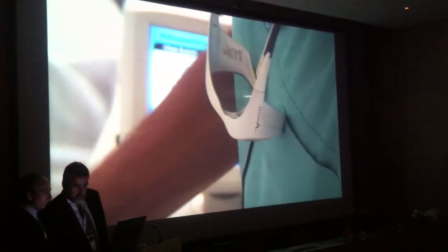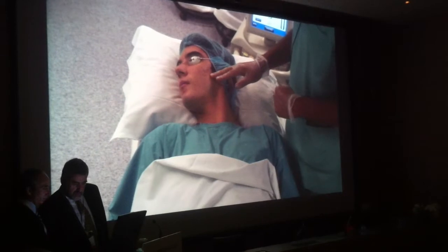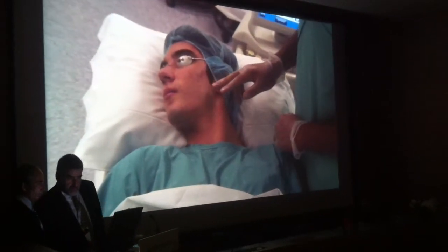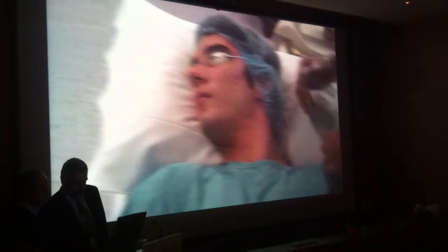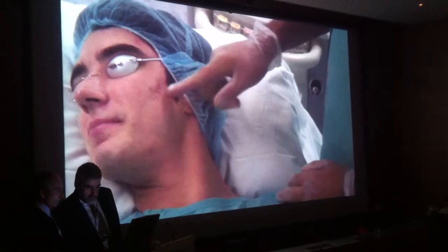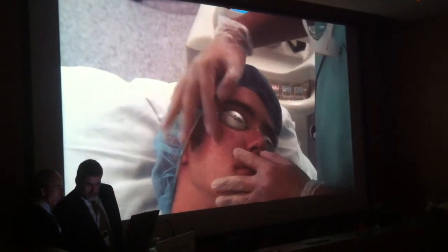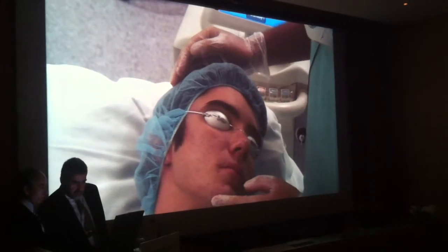We have, can you focus on the patient now, please? We have a 17-year-old with active acne scarring. That means you have evolving erythematous scars here. If you can zoom back in, please, I would be grateful so my colleagues in the audience can see the kind of problem. Now, when the patient is lying down, all scars are flattened, but these scars are quite deep. And you can see that on this other side, we also have quite deep scars.